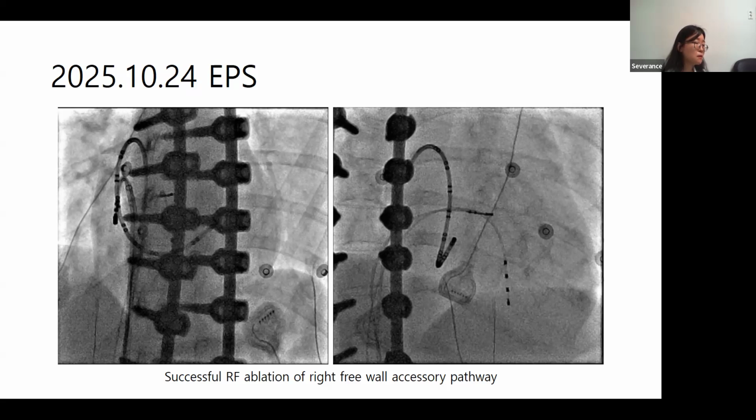If the sheath design is good for this patient, it is okay. However, if the SL or SR design is not good for this patient, it's difficult to manipulate the catheter. So I think a short one, for example 0 or 1, is easier to manipulate the catheter, and we have more liberty or freedom for catheter manipulation.